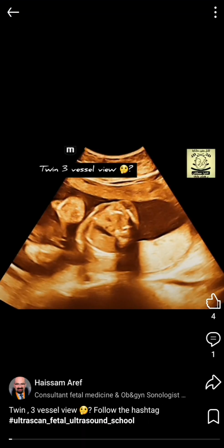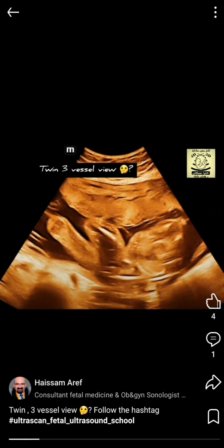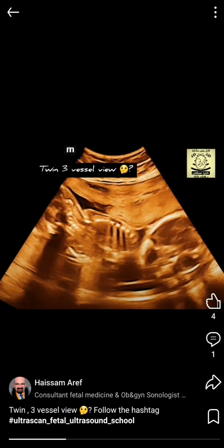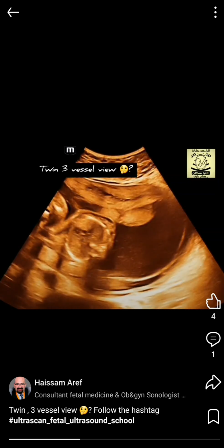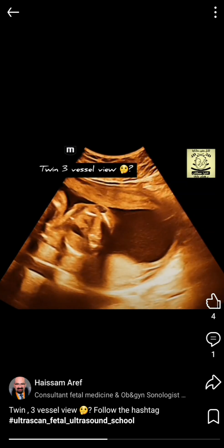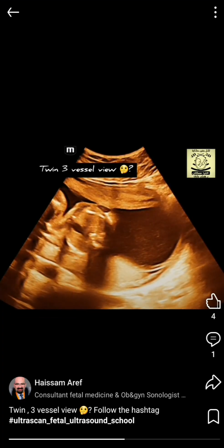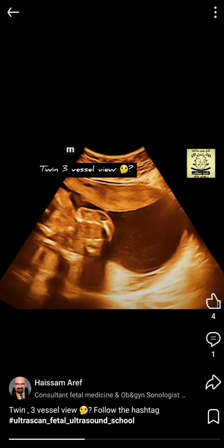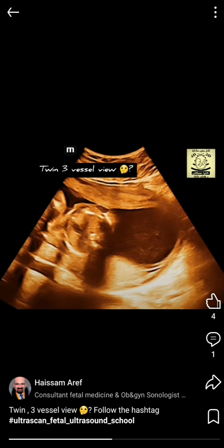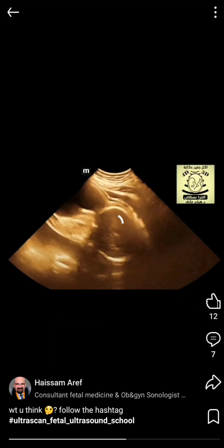We did have a case here showcasing a twin with the three vessel view, and one of them showing a smaller aorta in comparison to the pulmonary and the superior vena cava. So mostly this is a case of interrupted aortic arch in one of both fetuses, and the other is totally normal. You can see here, yes, in the other fetus, it's coming here, the image. Smaller aorta in comparison to the pulmonary.